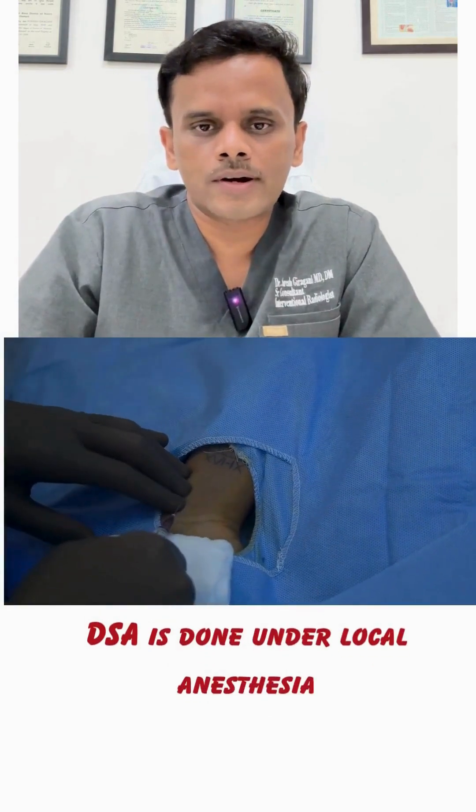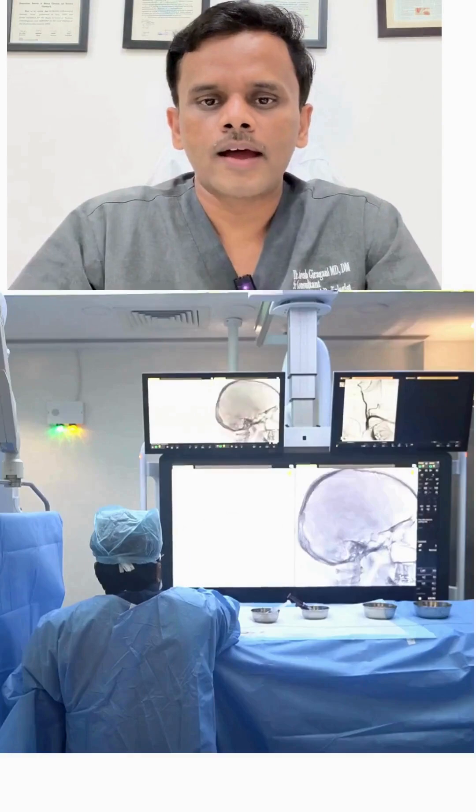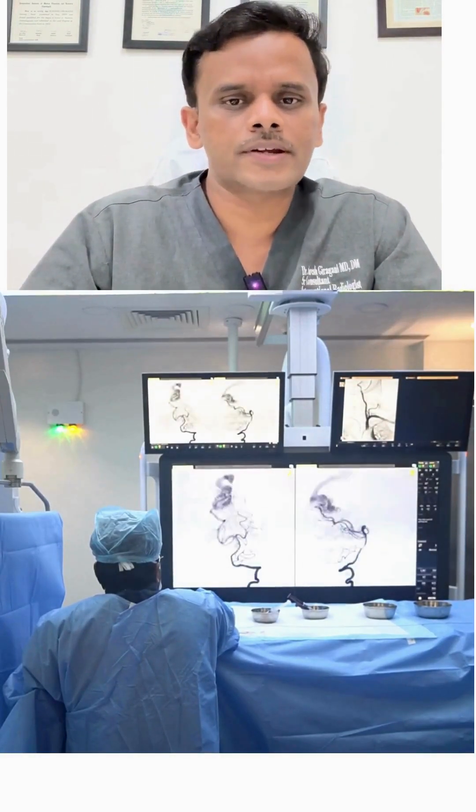It is done under local anesthesia, where the local anesthesia is given only to the wrist or the groin. Then the dye is injected and images and videos of brain blood vessels are taken.